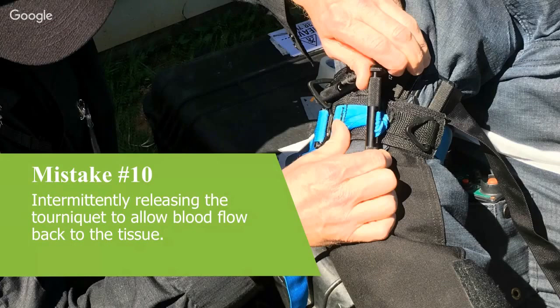Sarah, spot on. Check the distal pulse. Make sure the blood flow is being stopped. That's exactly right. So if you can still feel a distal pulse after you've put a tourniquet on, it's not tight enough. It hasn't done its job. You need it to be cutting off the artery, and you shouldn't be feeling any pulse distal to that. And that's exactly how you can check the effectiveness of your tourniquet. It should have stopped the arterial bleeding, so the wound shouldn't be bleeding any longer, but also there shouldn't be a distal pulse. Thanks for that, Sarah.